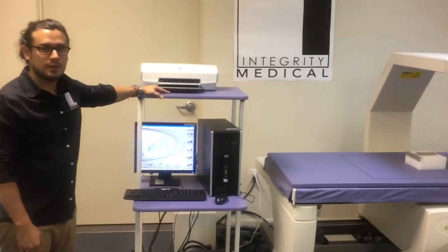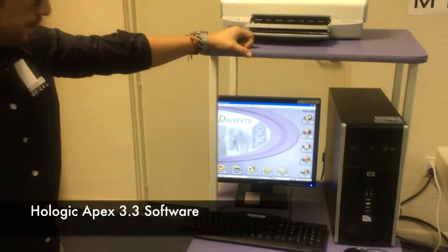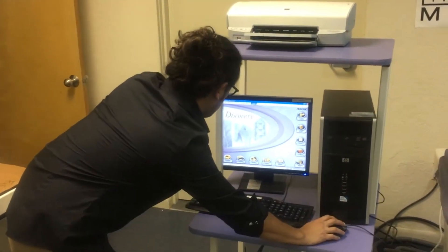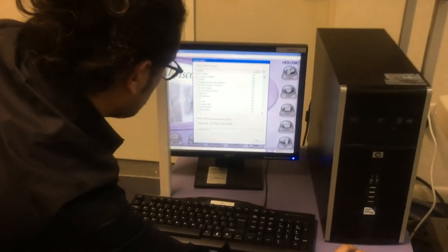As you can see, this is a Delphi working with the Discovery software. We're using Apex 3.3. One of the benefits with this software is you get the chance to purchase all these different options.